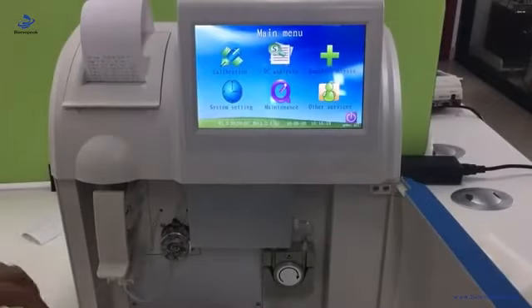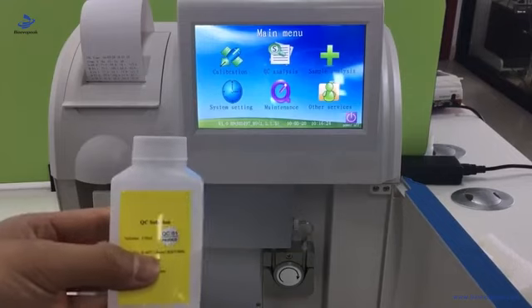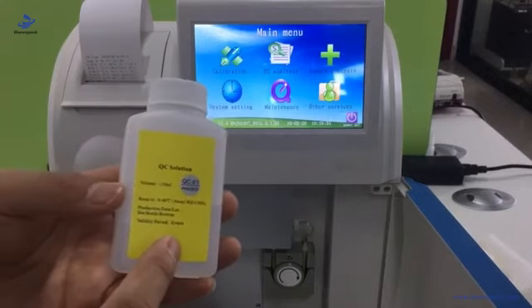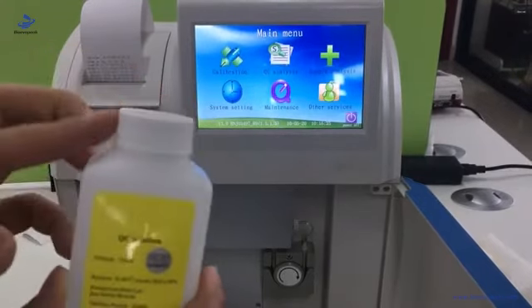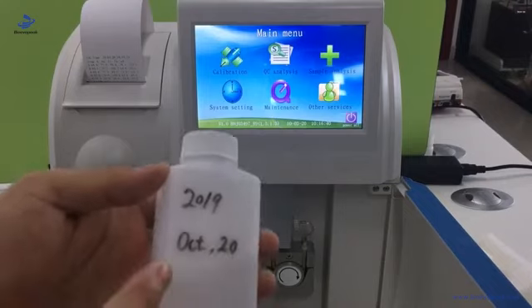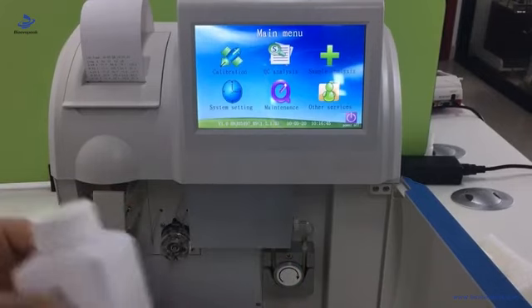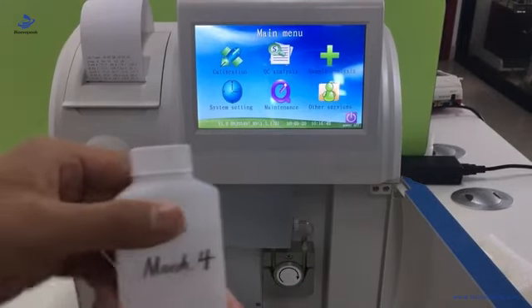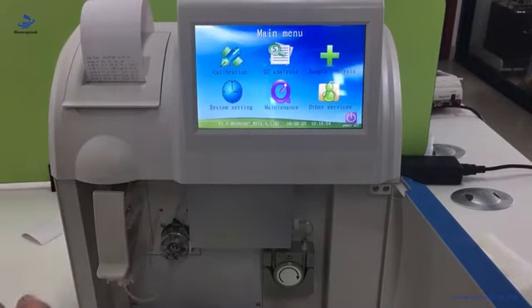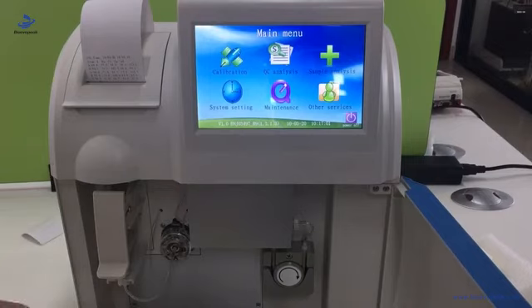Generally we use the QC solution as a sample to do the sample analysis for demo. The warranty period of the QC solution is two years, but once opened, the warranty period is only one month. So we need to use a marker pen to note down the open date on the bottle so it is obvious for the end user. The already-opened one is invalid, so we use another valid one.